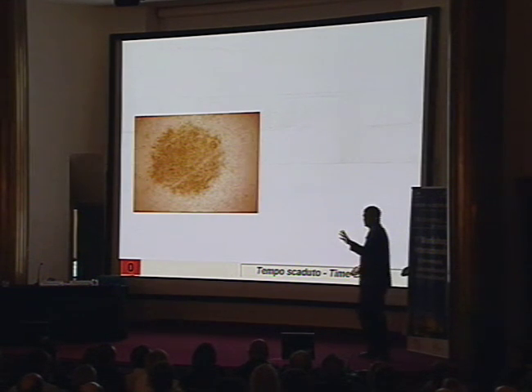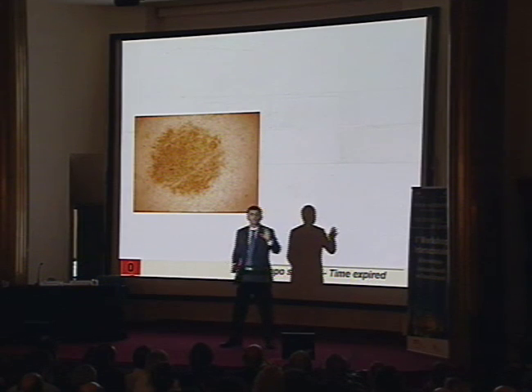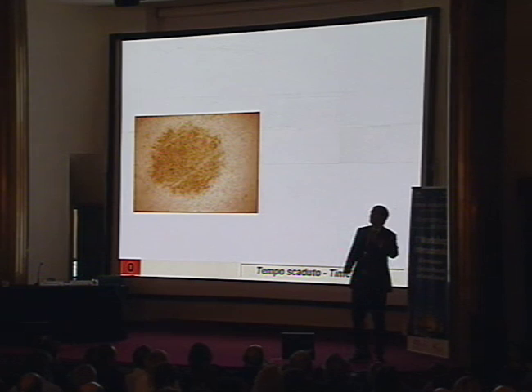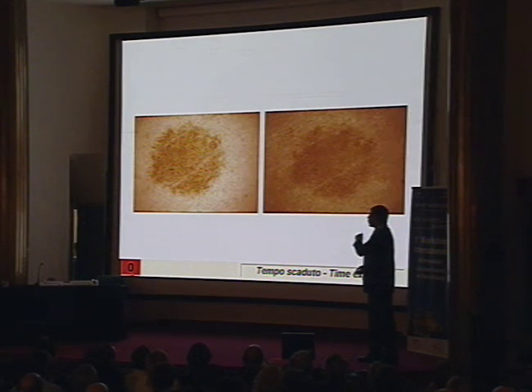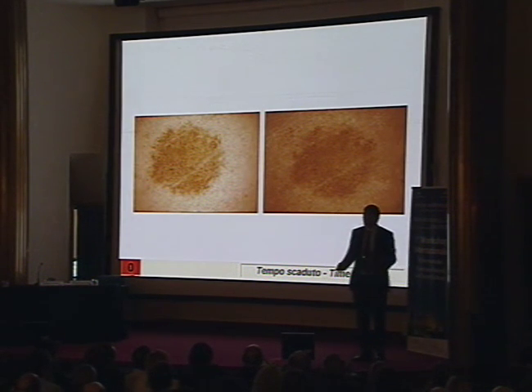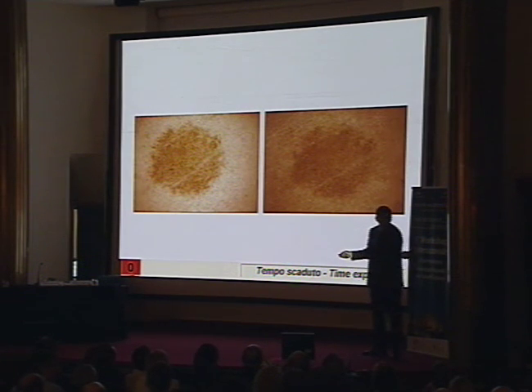So at the end, 5 examples. On the left side, the baseline images. On the right side, I will show the follow-up image. And you have to tell me now whether you expect change or not. What do you think? Will this lesion change, yes or no? No, so no melanoma. So what happened? The patient obviously had a visit on the beach or somewhere, or laid under a sunbed. It just darkened. But it is no significant change.